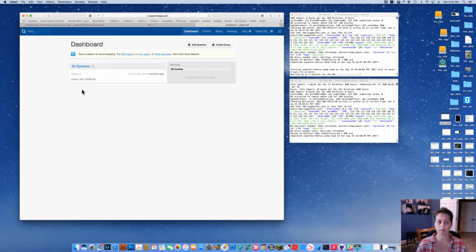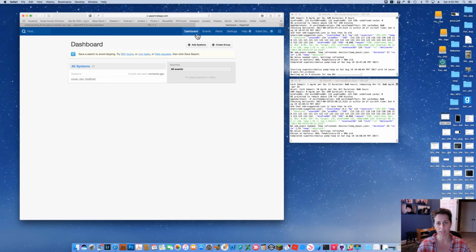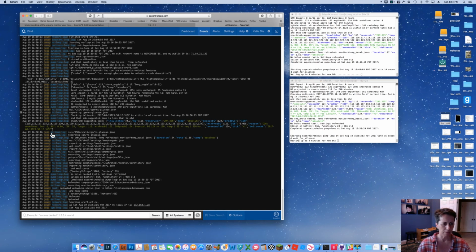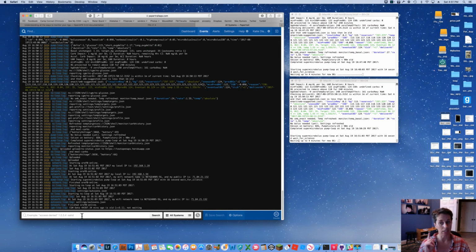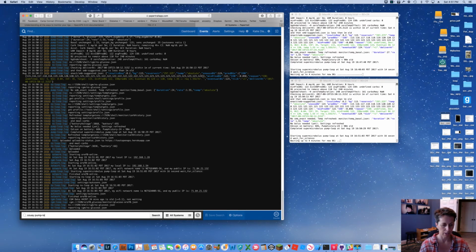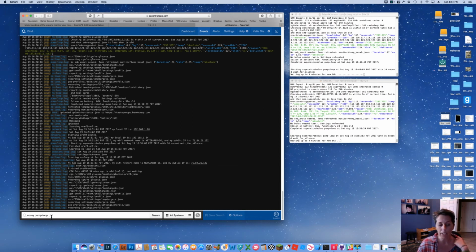And that's where setting up some filters comes in, search filters I call them. If you go into, say, Koozie, let's say this rig, and I want to do a filter, or you could start with events, you can start any way you want. Let's say I know I have both rigs uploading to this, all the different types of logs, but I really only want to see Koozie's pump log. So I'm going to put in koozie-pump loop, because that matches how this is set up, and I'm going to search.